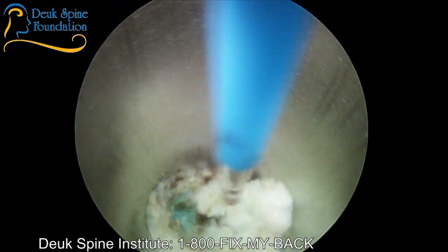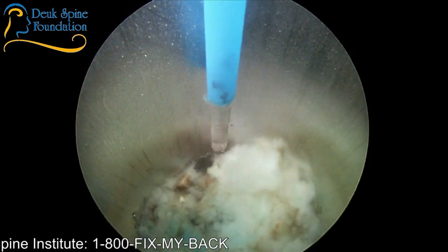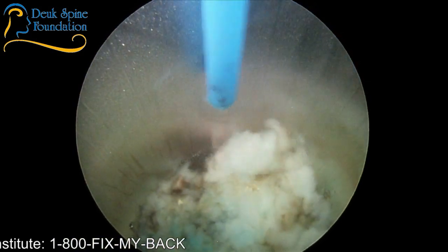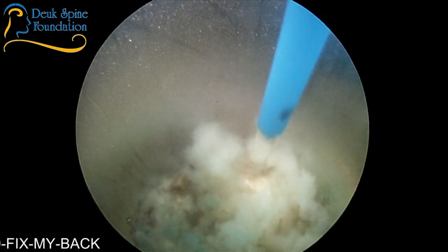Still blue. This is more lateral. This is annulus, part of the annular debridement. All right, any questions, Zach?